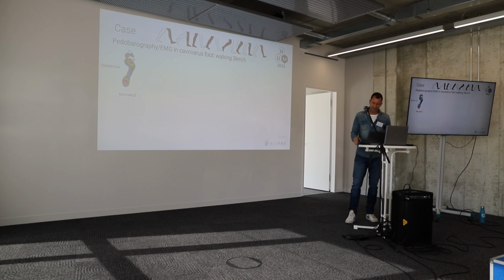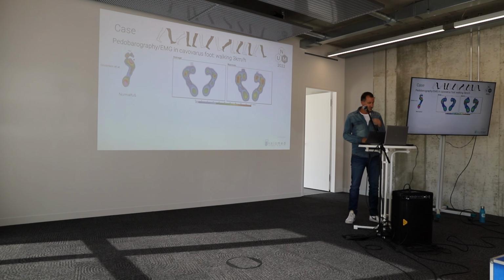Here are the pedobarographic results. We also know pretty well how it normally looks in a cavovarus foot, though it's hard to say because we have so many different degrees of severity and so many different types of cavovarus feet. But I think you can see that this doesn't look normal, here on the left side in our case. What can we see here? We can see a massive overload of the complete lateral foot, mainly in the area of the base and the head of the fifth metatarsal.